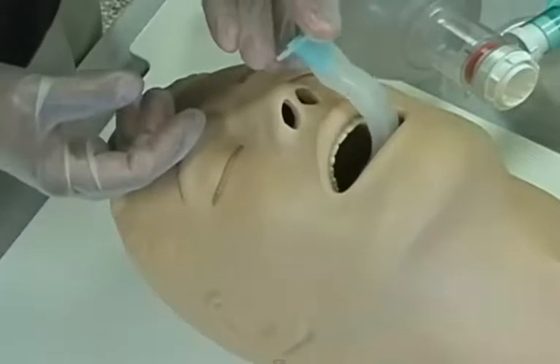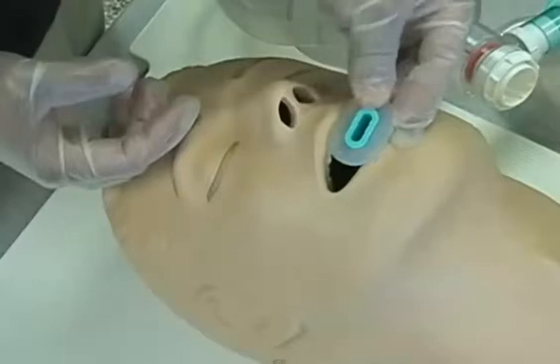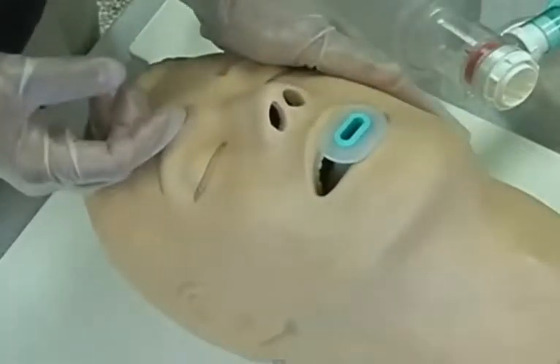Now we insert the oropharyngeal airway in the inverted position, and then as we sink it into place, we rotate it 180 degrees, and then it's in place.